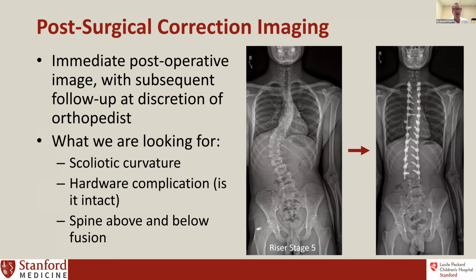Yeah, great. So next, Elizabeth, another good one. Can I request my daughter doesn't have x-rays taken at every appointment? She's 15 and currently braced, so I don't think it's progressing. Is it more important that she gets a film? So this is tricky. This gets into what Jesse touched on, the art of the treating physician. What's the risk of the x-ray relative to the chance that there's going to be a clinically significant finding on the x-ray, such as curve progression? So it's hard for us to say no, she doesn't need it.